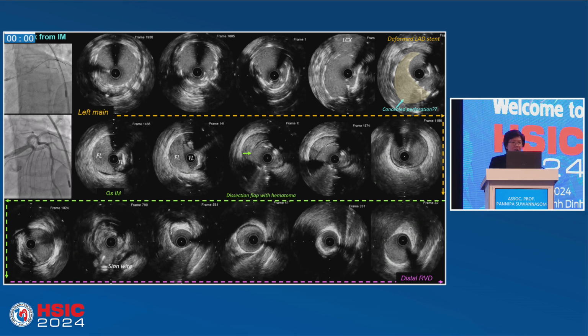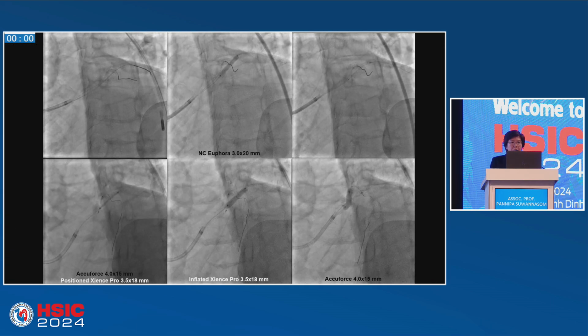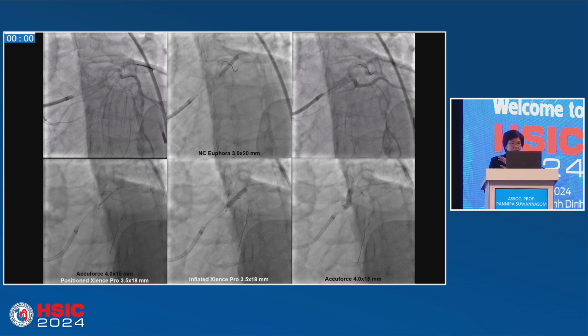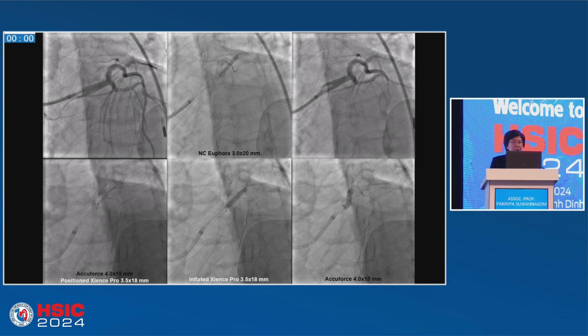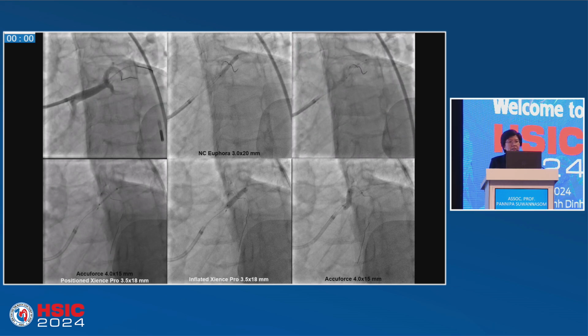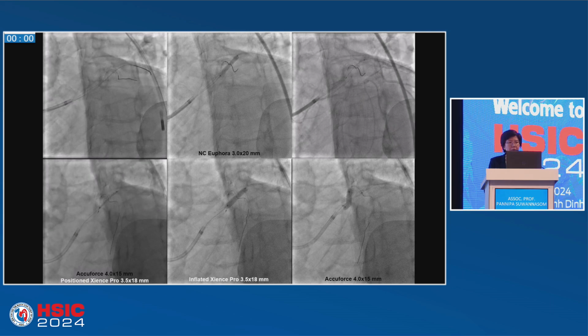The problem is because we have hematoma here. This lumen is the true lumen, and there is a dissection of the ostium of the left main, which I consider maybe happened when I did the NSE for the lesion preparation. So what I did is I used the NC balloon to open the strut, because now I'm sure that I'm in the true lumen, and then I implant the stent.